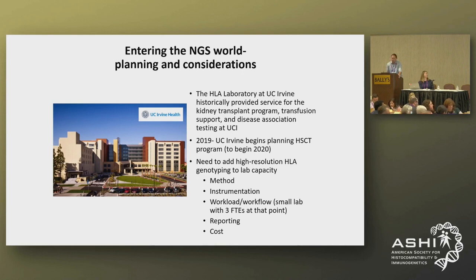We had to think about the things that we always think about when adding testing: method, instrumentation, workload, workflow, reporting, and cost. And we had to think about this in the framework of having a small lab that really didn't have experience with supporting high-resolution typing, DNA sequencing, or bone marrow transplant.